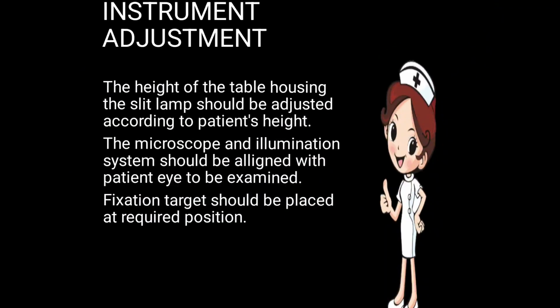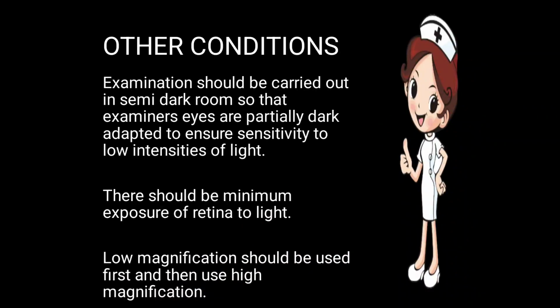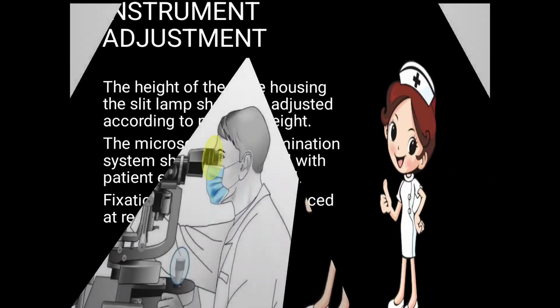Next one is instrument adjustment. The height of the table housing the slit lamp should be adjusted according to the patient height. The microscope and the illumination system should be aligned with the patient eye to be examined. Fixation targets should be placed at a required position. Okay, so let's see once.